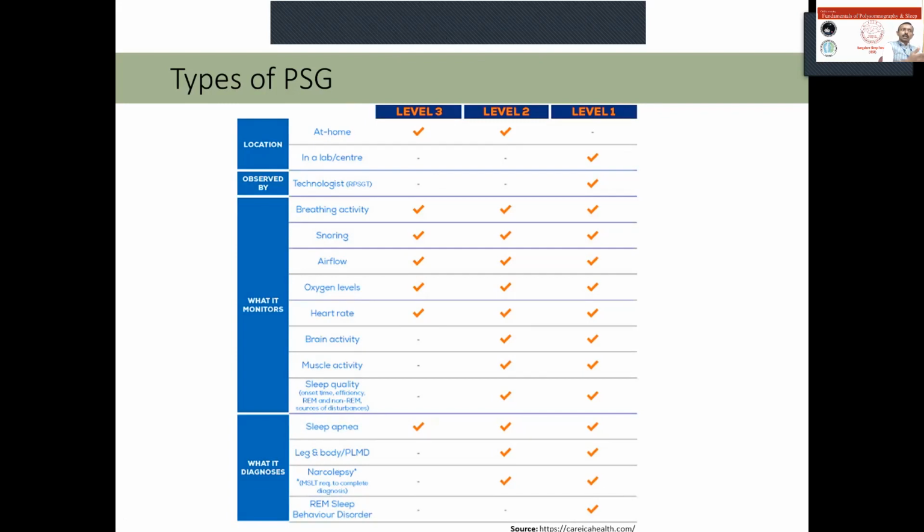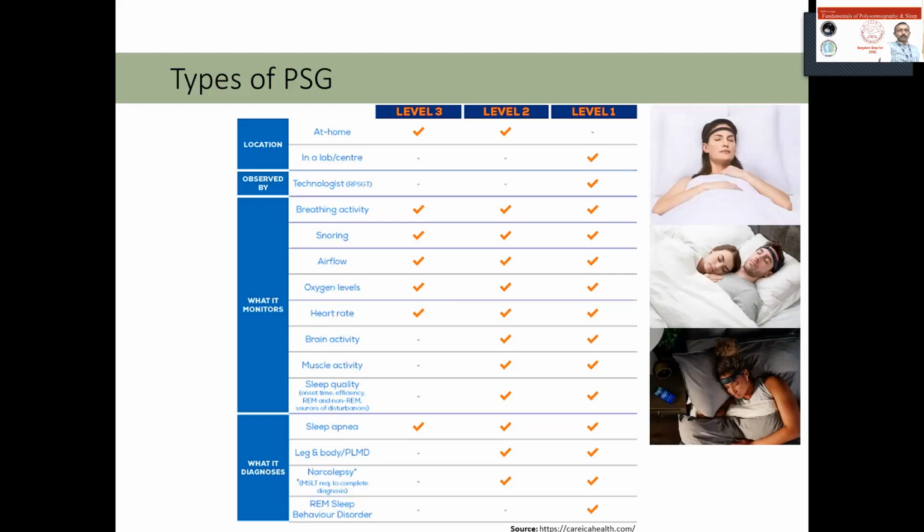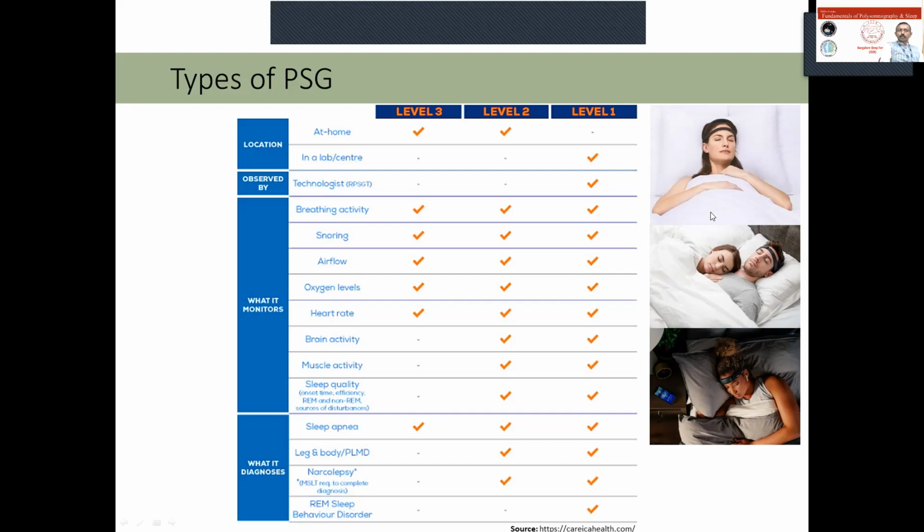If you still need brain activity or actigraphy, there are even much more portable EEG devices. They probably also come under level 3, but they are not usually classified as such. This level 1, 2, 3 is usually a classification targeting sleep apnea evaluation. As I mentioned, there are now EEG devices under 50,000 which are consumer grade and can be used for sleep measurements. So you can do this across hundreds and hundreds of people and get compiled results.